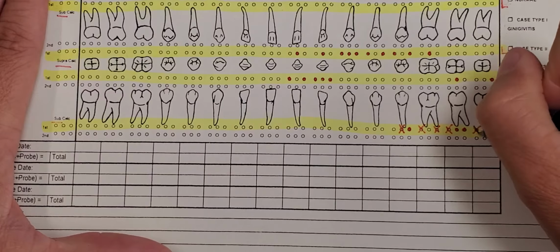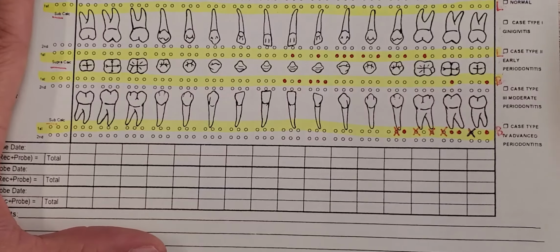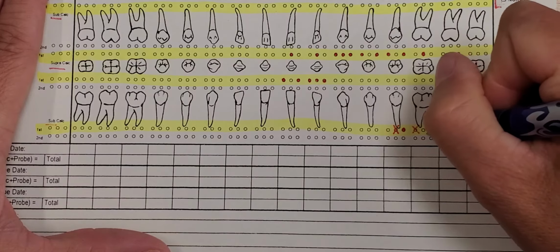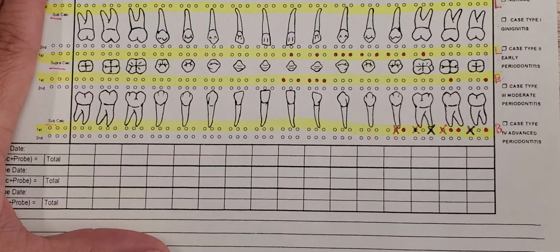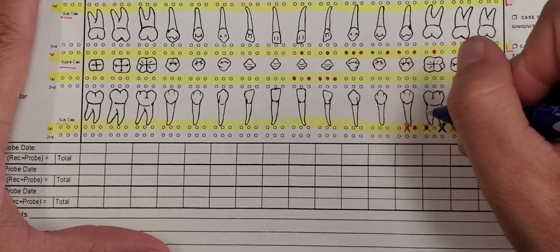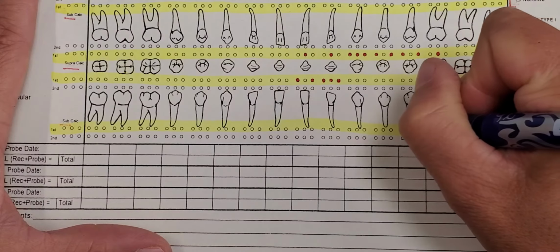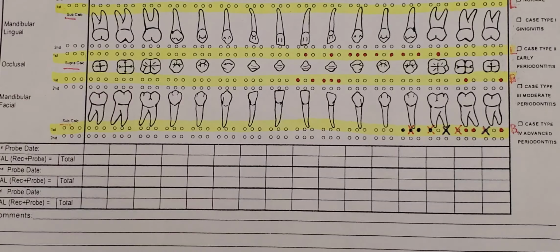So they're going to come along and say, I agree with your calculus number 17, mesial buccal. There's a definite. You go over your red X with a blue X. They're going to say, I feel the distal definite on 19, but not the mesial. I think that's roughness. And you fill in a circle. Number 20, roughness on the distal, straight, and mesial. And you might end up with something that looks like that.